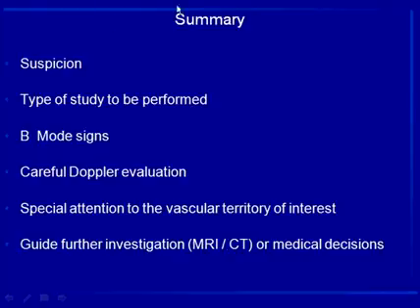The summary: suspicion of the pathology, the type of the study to be performed. We can identify the B-mode signs, a careful Doppler evaluation with special attention to the vascular territory of interest, and guide further investigations with MRI, CT, or medical decisions.